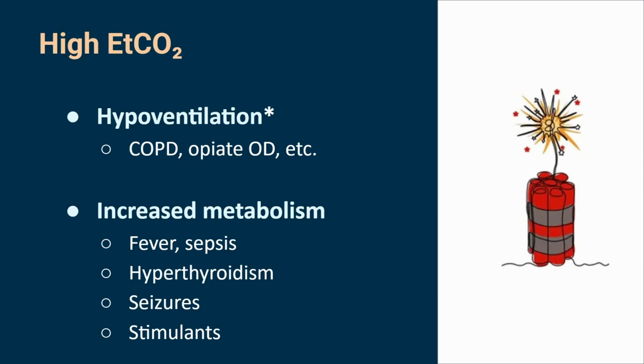And so hypoventilation can lead to high end tidal. The question is, what's your timeline like though, right? Do you have a partially obstructed airway that is somehow leading to a high end tidal, or do you have a completely obstructed one, and then you go from high EtCO2 to low CO2 in the blink of an eye? But in general, hypoventilation. That means your guy ODs on some opiates, and before you ventilate and give him Narcan, his CO2 is just building up and up and up. It's why once we start ventilating him, we might see a high end tidal because he's got a lot in him.